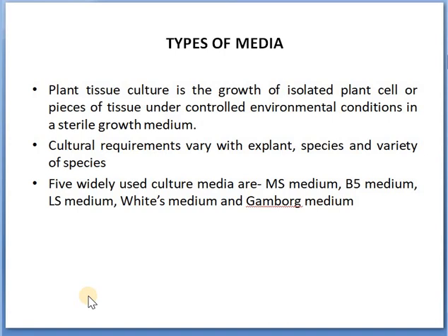The exact conditions required to initiate and sustain plant cells in culture or to regenerate intact plants from these cultured cells are different for each plant species. Each variety of a species will have a specific set of cultural requirements, one among which is the media. Five widely used culture media are described in this session briefly.